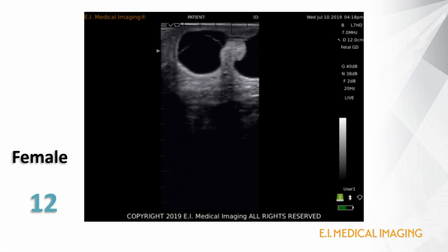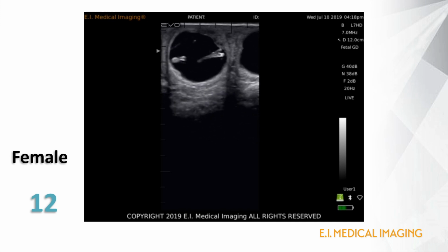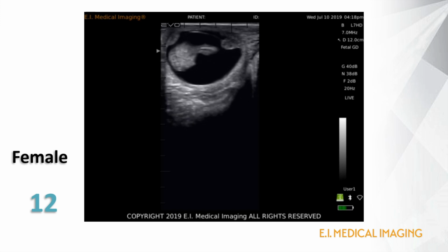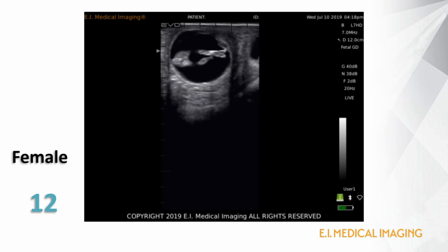It's a 64-day pregnancy in the transverse plane. The video clip starts at the hind end of the fetus, where we'd see a distinct tail, female GT, and two hind limbs. We then move forward to inspect the umbilical region and confirm that there's no male GT present. This is a heifer calf.